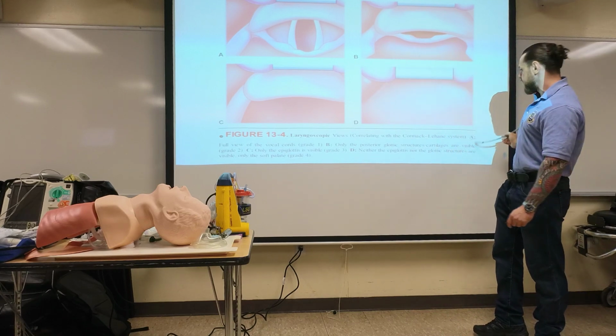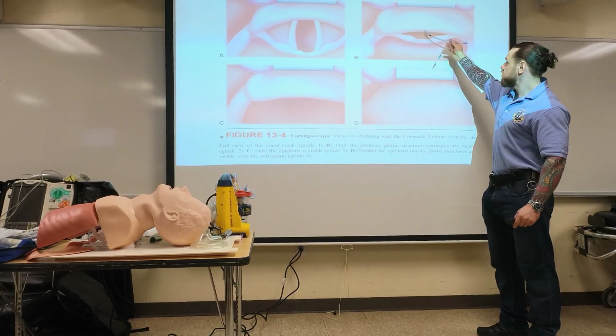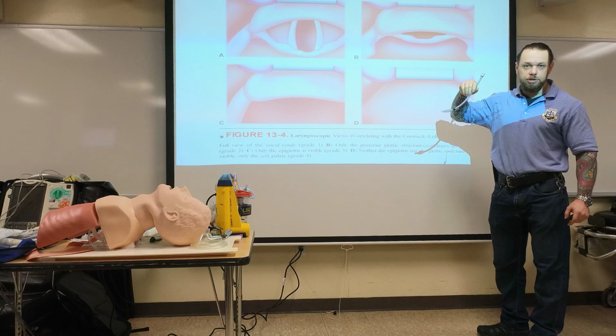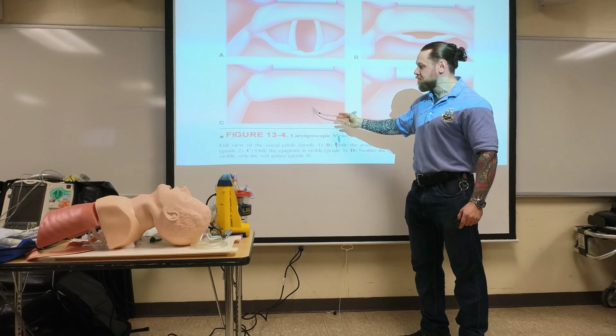Even with all the good positioning and everything, you may have this type of airway. This is Cormack-Lehane grade 2. You see, it's a B. Grade 2. You could only see the epiglottis and just the laryngeal inlet slightly, with a notch. We'll talk about some of the techniques you could use. Not going to be today, but I'll explain to you with the gum elastic bougie how we could use that.